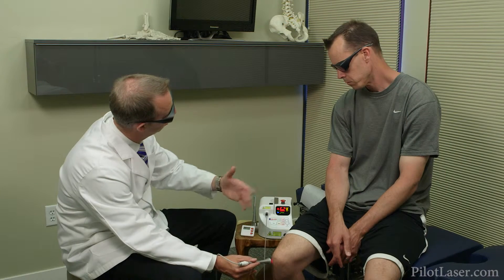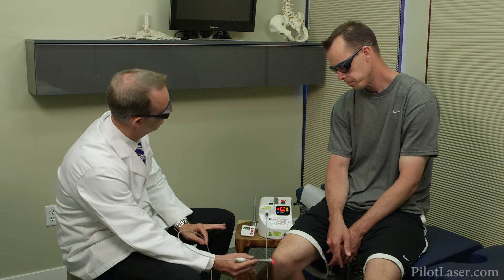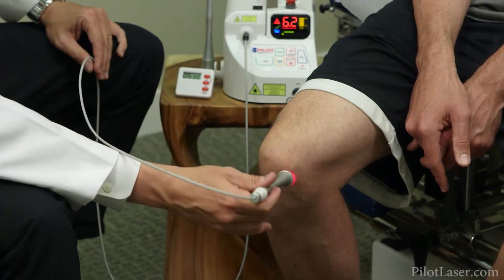You'll want to communicate with your patient to find out if the laser is uncomfortable or if he or she is feeling a soothing warm feeling. If it is uncomfortable, you want to either move faster or lower the wattage. Often the patient will notice that the treatment area feels warm while the laser is in use, and many patients will notice a difference in pain reduction as soon as they get up from the procedure.